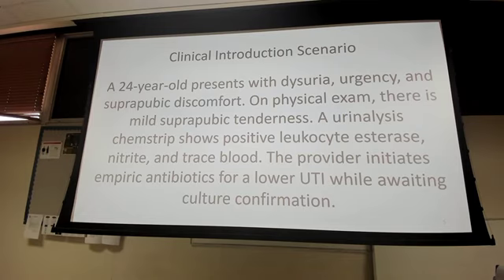Casts. Okay, what about those casts? Waxy cast. Yeah, you remember that waxy cast, right? Okay, we're gonna go into a little bit more casts. What else can you find? So when we do the dipstick, what are we testing for? Yeah. Okay. So y'all pretty much read it this afternoon, but you gotta read the slides.